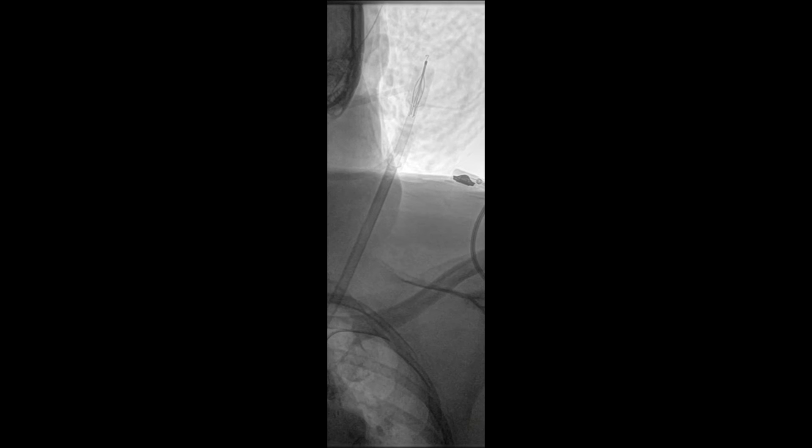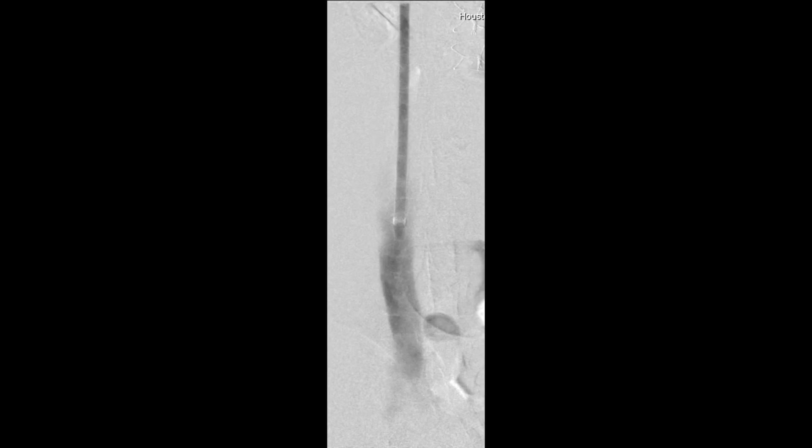Fluoroscopic surveillance revealed an intact filter removed. Post-removal venogram did not indicate any evidence of extravasation or filter components left behind. During removal, several safety checks were performed to ensure no excess stress was placed on the heart. The IVC filter was examined on the back table and confirmed to have all 12 prongs and components intact, confirmed by multiple OR staff members.